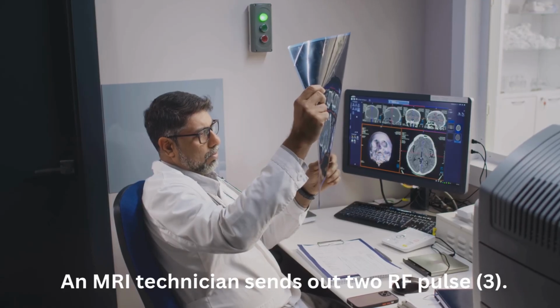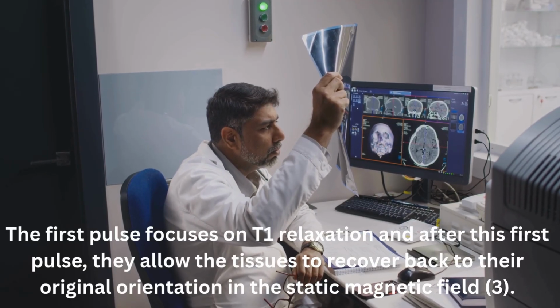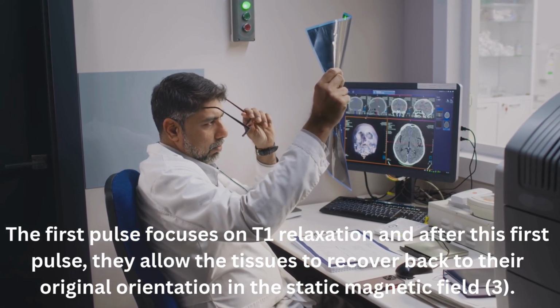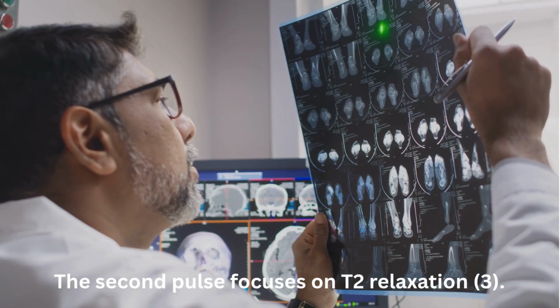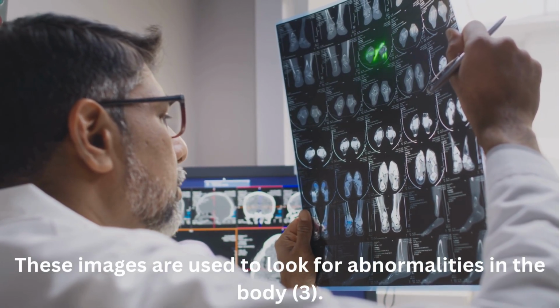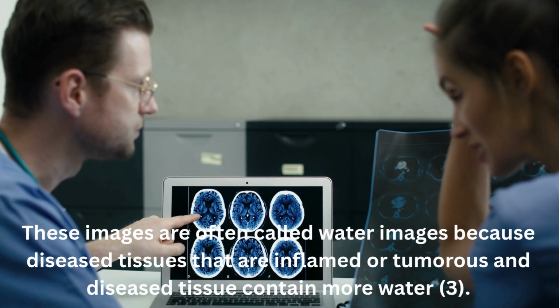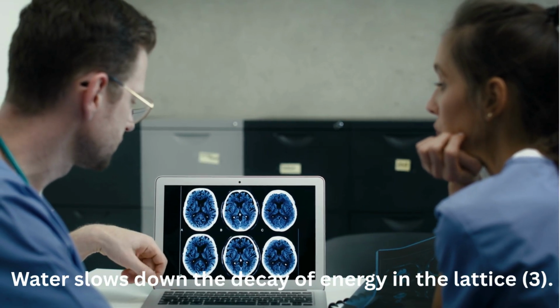An MRI technician will send out 2 RF pulses. The first pulse focuses on T1 relaxation. After this first pulse, they allow the tissues to recover back to their original orientation in the static magnetic field. These T1 images are used to show anatomy. The second pulse focuses on T2 relaxation. These images are used to look for abnormalities in the body. These images are often called water images because diseased tissues that are inflamed or tumorous contain more water. Water slows down the decay of energy in the lattice.